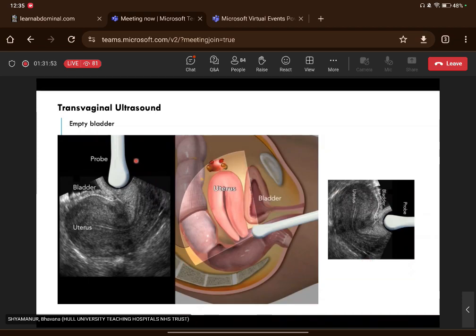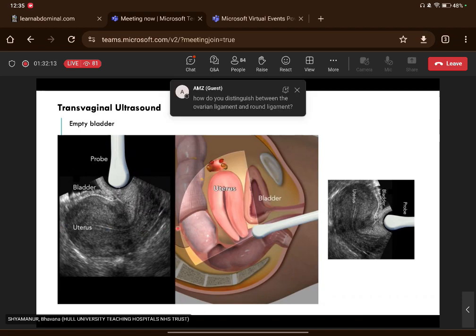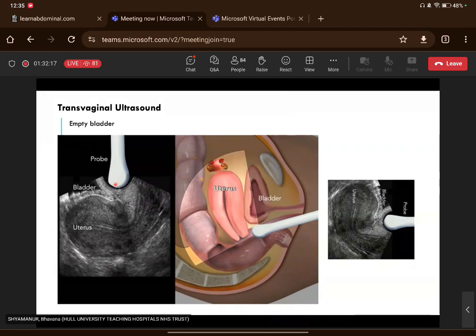overview. But on the ultrasound screen, it is, of course, oriented so that your probe is at the superior aspect of the screen. So this to the right of the screen is upwards or cranially in the patient, and to the other side of the screen is caudally in the patient. So cranial and caudal, and of course this is superficial and this is deep with respect to where the probe is.